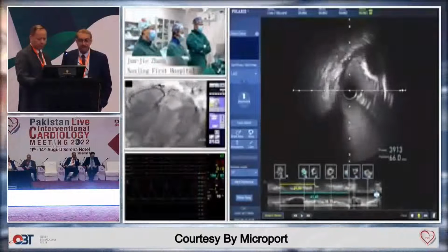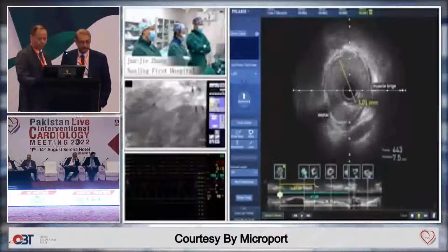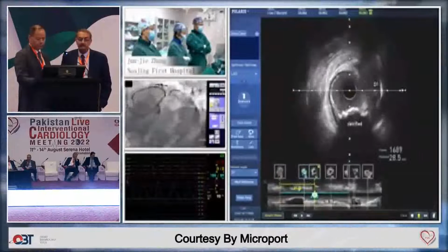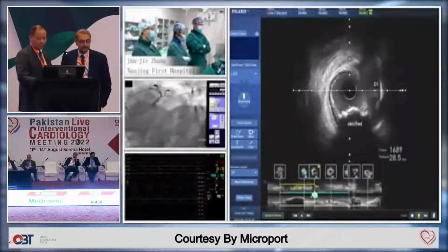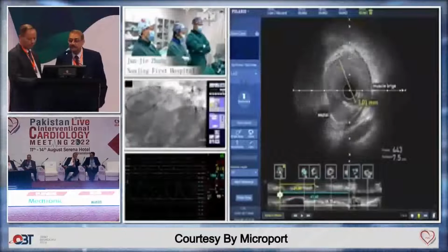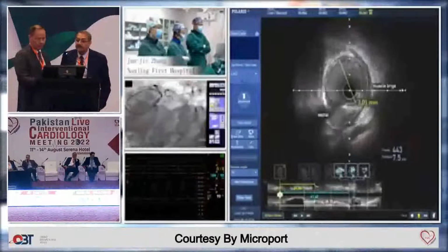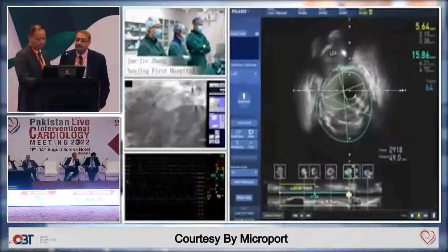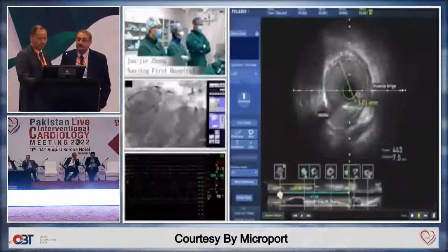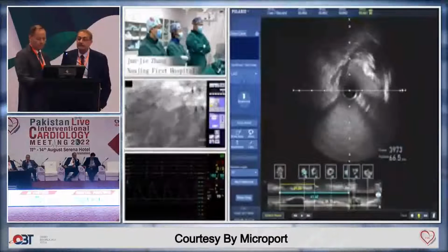We measured the lesion length from the distal reference to diagonal 1 as 21 millimeter. The length from the distal reference to ostium LAD is 41 millimeter. And the whole length from the distal reference to ostium left main is about 58 millimeter.